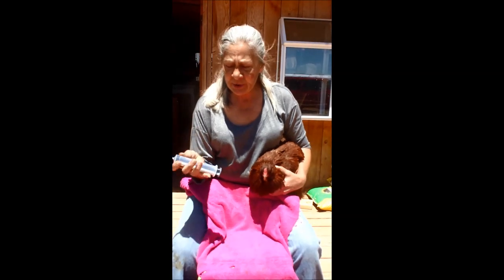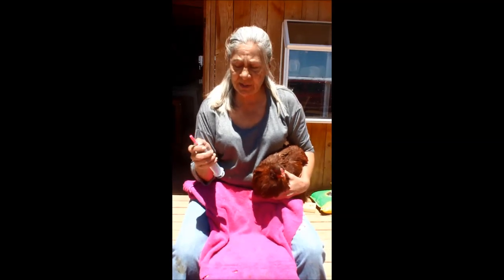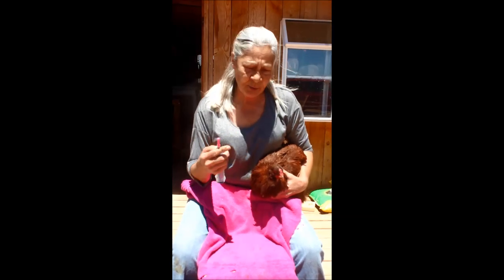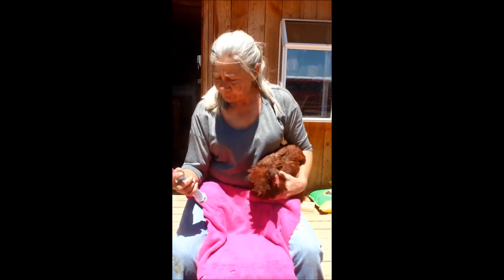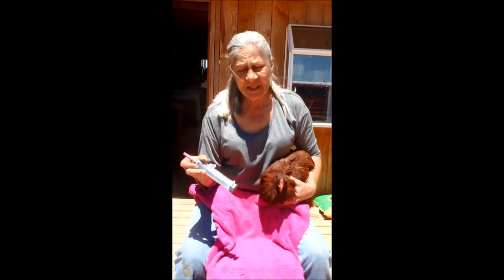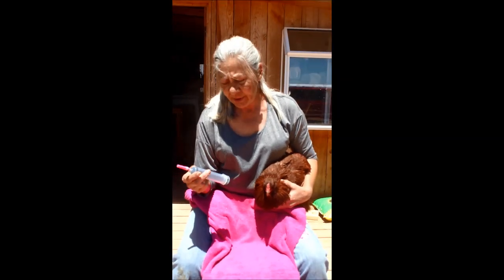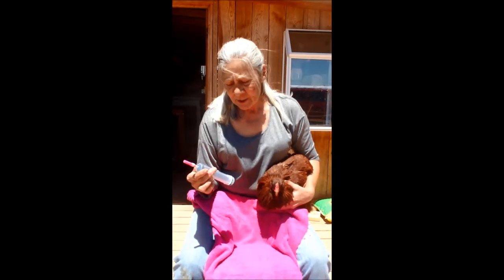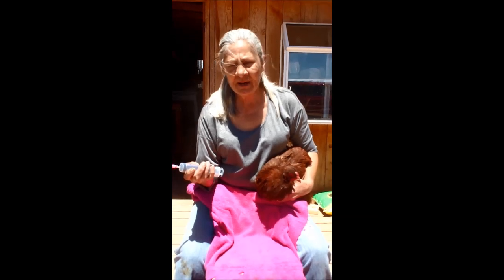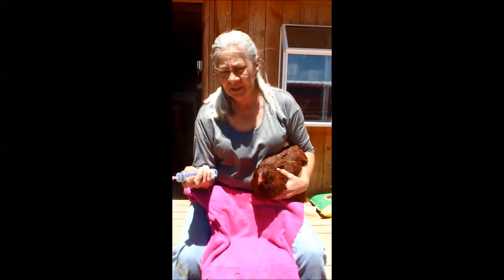If you're drawing it out and you get your syringe full and it obviously hasn't finished draining, then just disconnect the syringe, leave the needle in there, and drain the bird into another larger container. So we have a 60 ml syringe here. I think we're probably going to get almost 2 cups of fluid out of this bird. I'm not going to drain more than 1.5 cups or 2 cups. You can send them into shock if you pull too much of the fluid off at once.